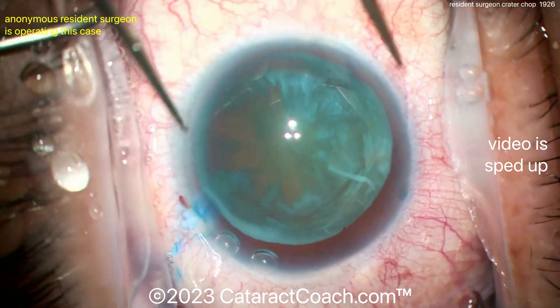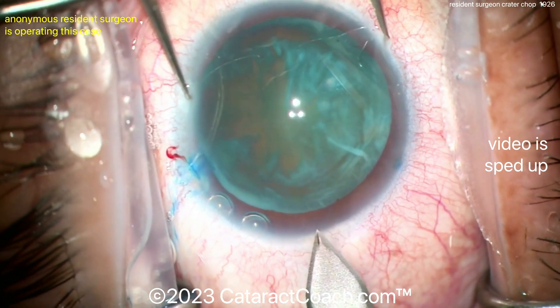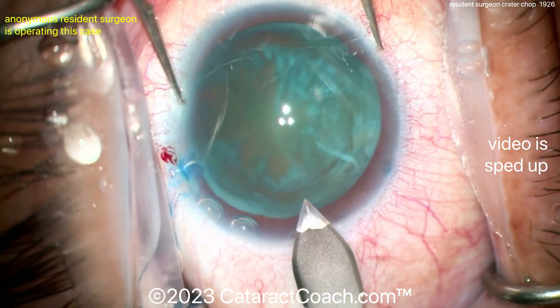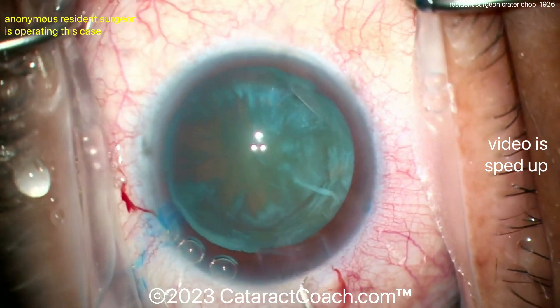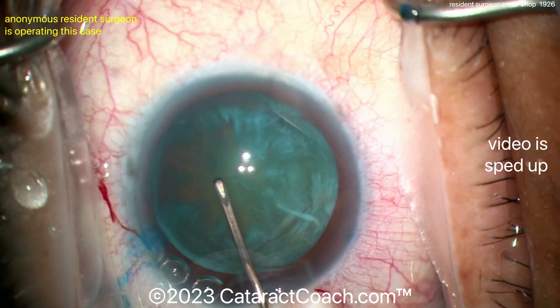There's a good fill of viscoelastic. Let's watch the main incision — you can always tell a resident surgeon by the main incision. Pretty good actually; it looks like a two-plane incision. I like the tunnel length and a little bit of nicking of a limbal vessel, which I like as well.